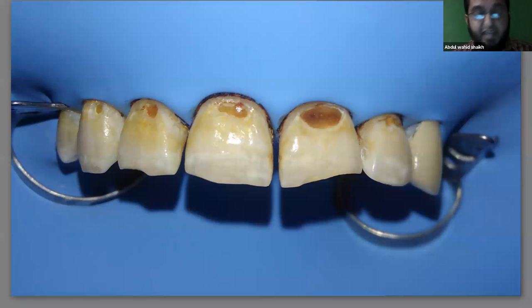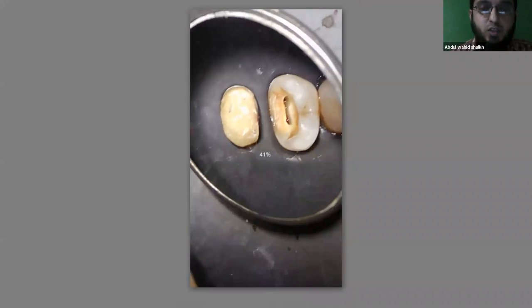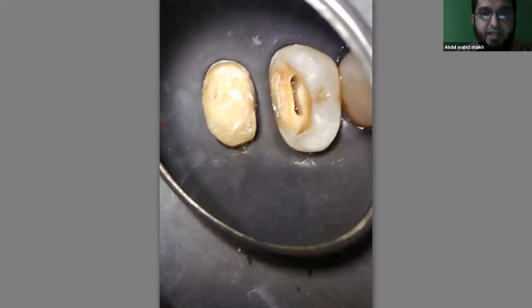A clean and dry isolation sets the mood — just like when we were in school and tried to write neatly on the first pages of a new book. Similarly, clean isolation sets the mood for clean work. For example, in a pre-endodontic buildup on this premolar, there was a lot of bleeding. After isolation with rubber dam, the bleeding is underneath and the rubber dam embraces the neck of the tooth tightly, not allowing any fluid or saliva to leach out.